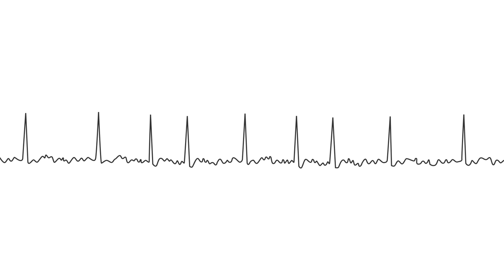Typically, these QRS complexes are narrow or less than 120 ms, unless there is conduction through an aberrant pathway or a bundle branch block. But for simplicity's sake, most atrial fibrillation will present with a narrow QRS complex.